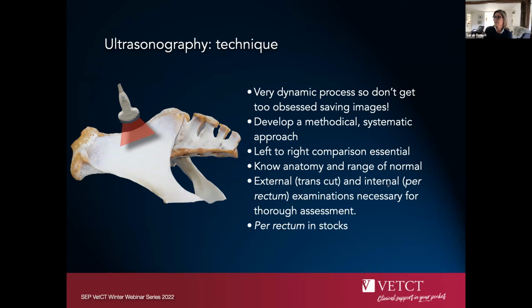External transcutaneous and per-rectal examinations are necessary for thorough assessment, though they might not be indicated in every case. And I would always encourage people to use stocks if you're scanning per rectum. I've just had too many colleagues over the years that have been injured, being a hero and doing it in the stable. I have done that myself, but I certainly wouldn't do it now.